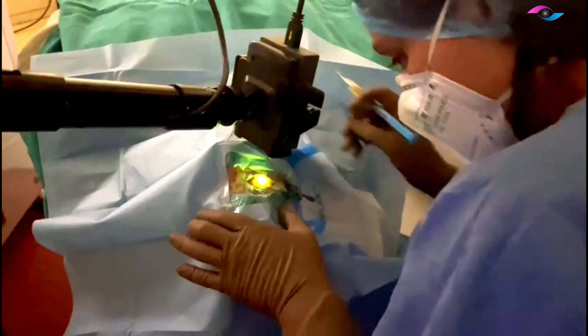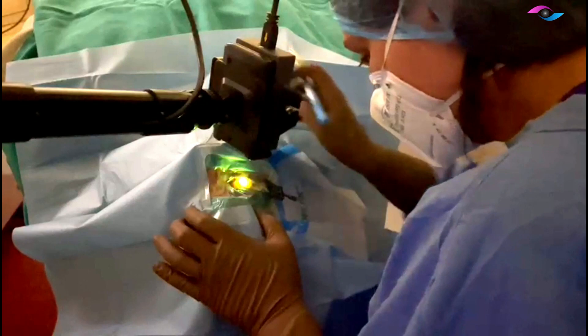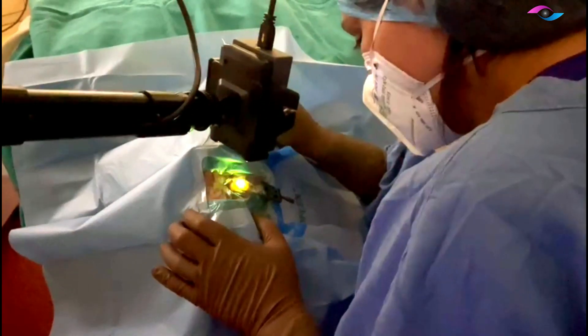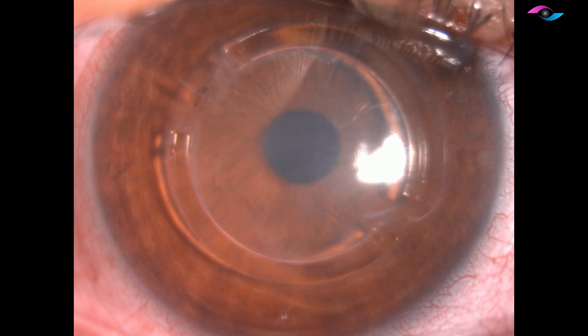We then switch on our UV lamp, and while giving the UV radiation we keep instilling the drops every two minutes. Towards the end of the surgery, we place a bandage contact lens on the eye and then the patient is called for follow-up. At one month post-op, we remove the suture.